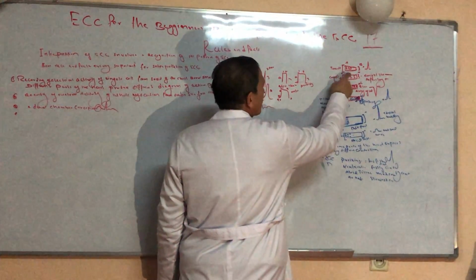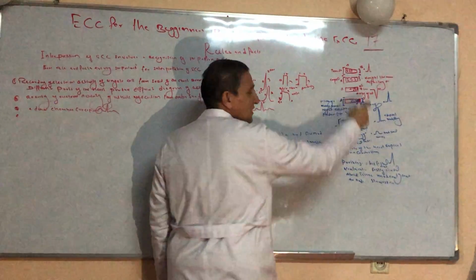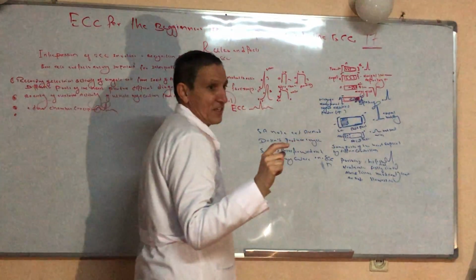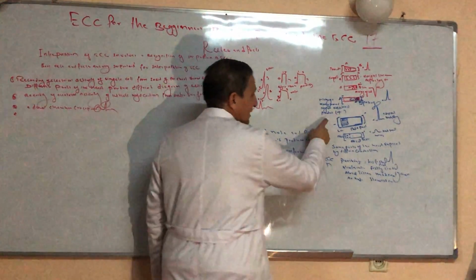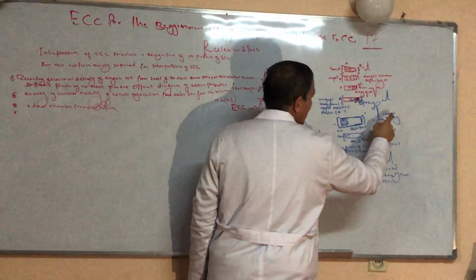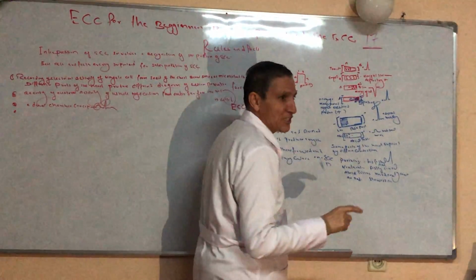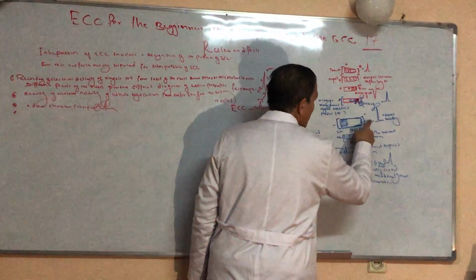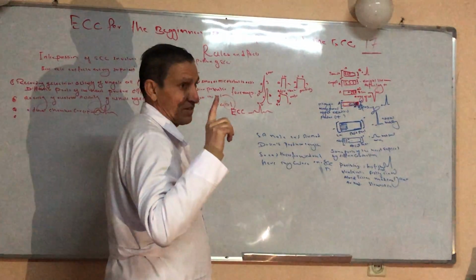Remember, in this case, the positive charge moves toward the positive electrode, the deflection in the needle would be positive. But this piece is a small piece, so it produces a small deflection. Right now we have a large part of the myocardial tissue, the left ventricle. With the left ventricle, the positive charge moves toward the positive electrode, the deflection in the needle is positive, but strongly positive. That is why the left ventricle exerts more influence on the ECG compared to the rest of the heart.